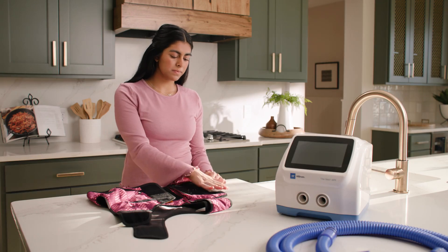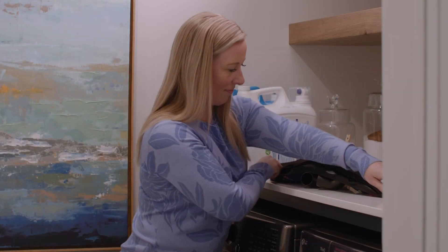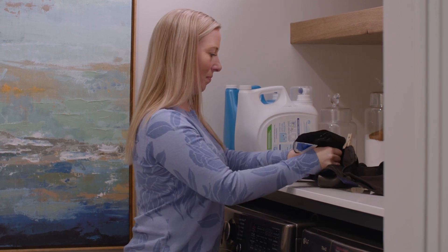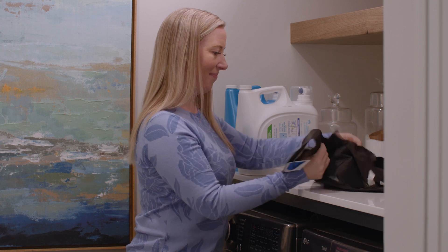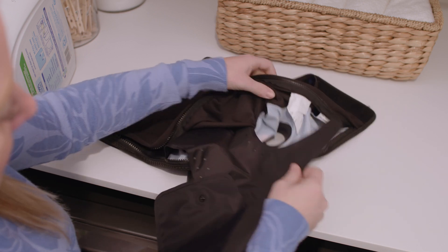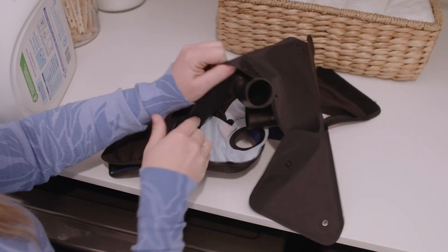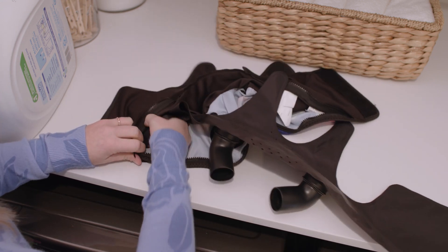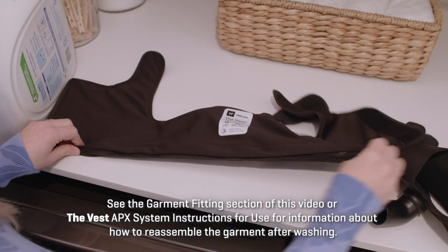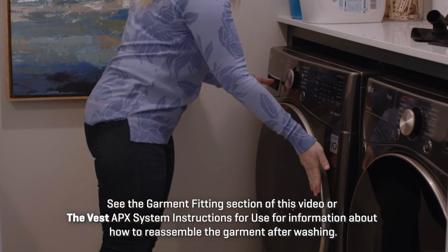To clean the outer garment, first use a piece of clear tape to remove any lint and fluff caught on the Velcro brand closures. Only wash the outer garment after the bladder has been removed. We recommend reconnecting the Velcro brand closures on the shoulders and sizing panel before washing to help maintain the quality of your garment. You can hand wash the garment or machine wash it in a cold cycle only with detergent. Do not machine wash or dry the bladder. Hang or tumble dry the garment on your dryer's lowest temperature. Cool iron as necessary, but do not iron the logo design. See the Garment Fitting section of this video or the Vest APX system instructions for use for information about how to reassemble the garment after washing.